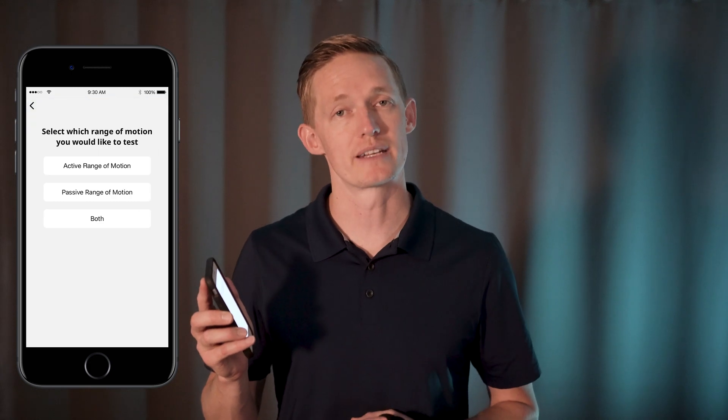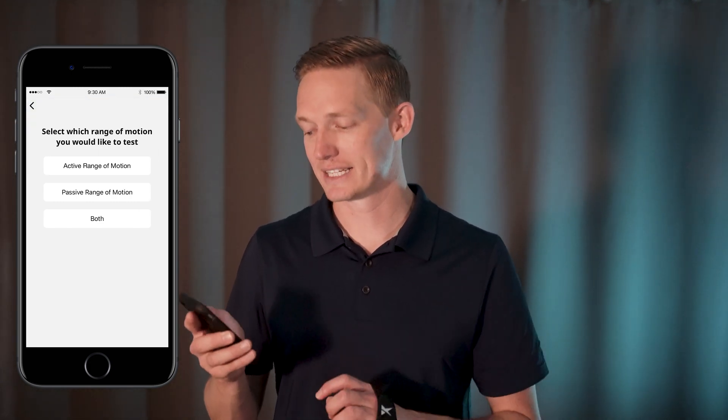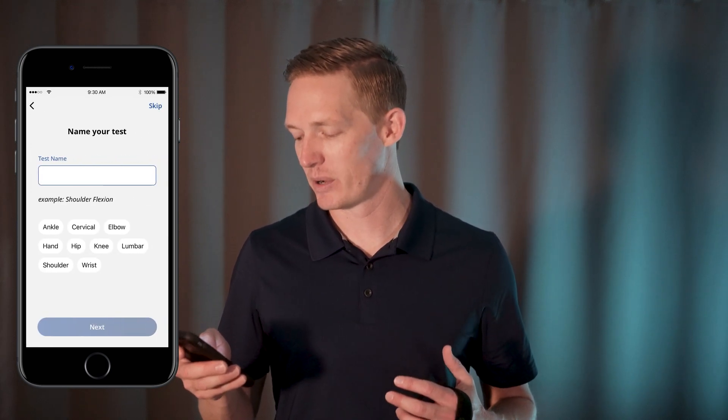In order to perform a range of motion measurement, you want to tap that range of motion button and select the range of motion test you wish to perform. For the sake of this example, I'm going to tap active range of motion and perform a left elbow flexion standing.